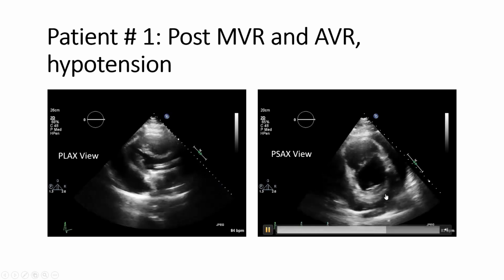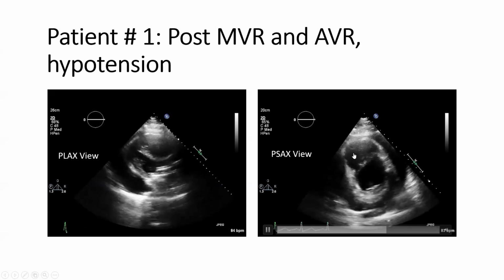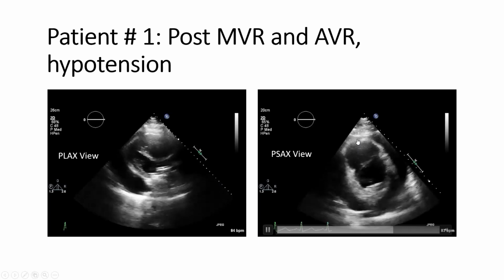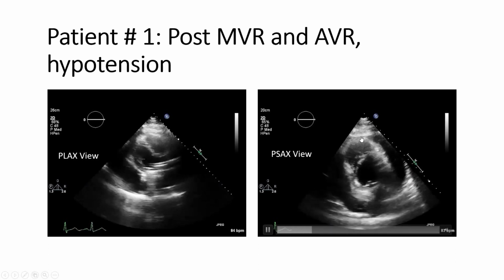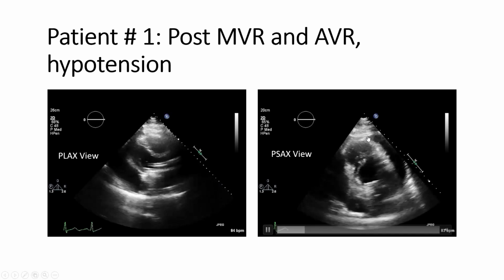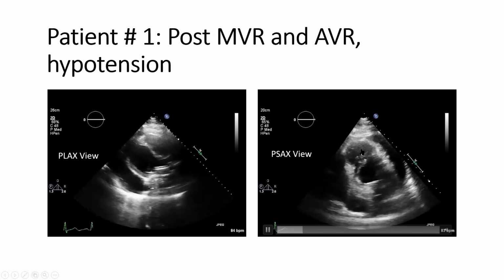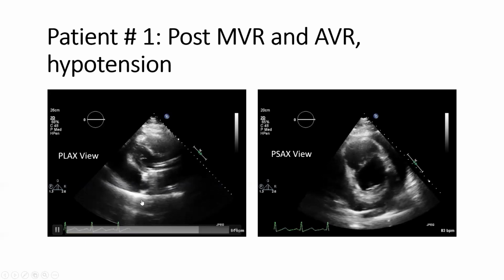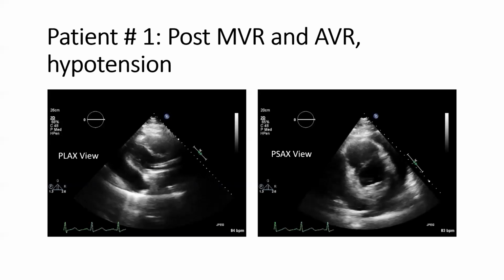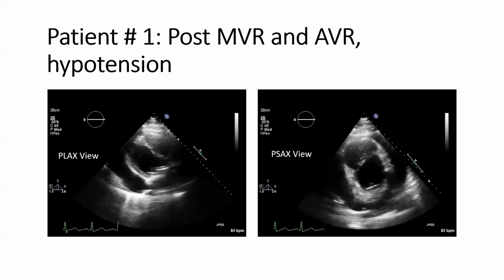When you go to the parasternal short axis view, the fact that there is a circumferential large pericardial effusion is pretty obvious. RV is dilated, RV is dysfunctioning, and anteriorly, the pericardium over the RV free wall, the two layers are kind of adherent. This is an acute process because of thoracotomy. And you can also see that this white line, which is the parietal pericardium, and the second white line, which is the visceral pericardium, they kind of pull on each other because of the adhesion. All of that is pretty obvious. My question to you, and if you have an answer, you can put it in the chat box. What else are we seeing in this patient's clips that should concern us?